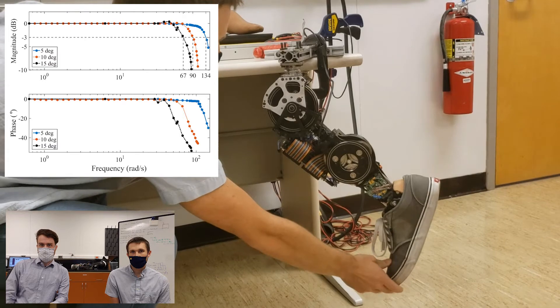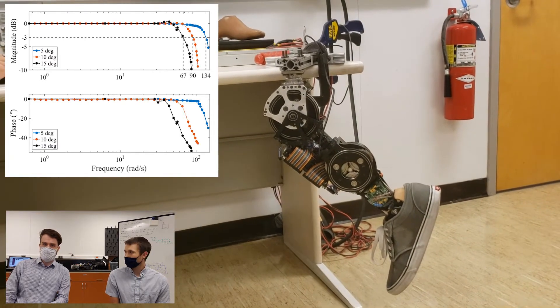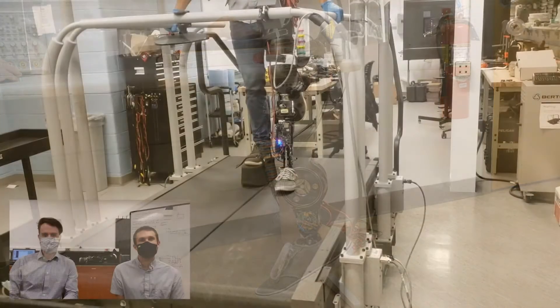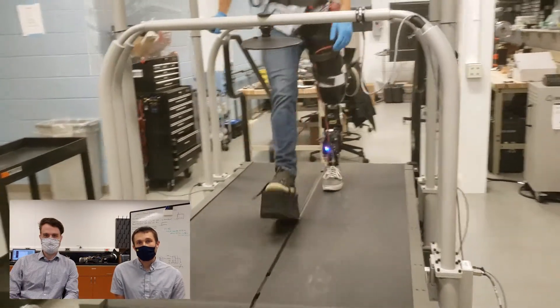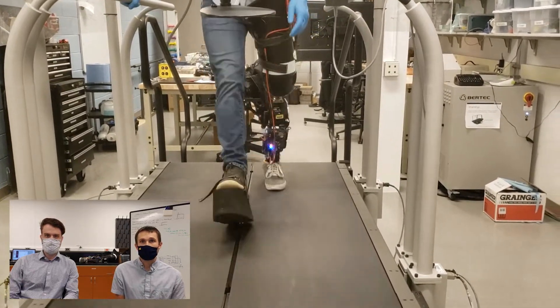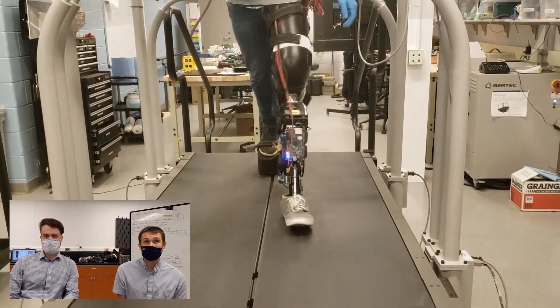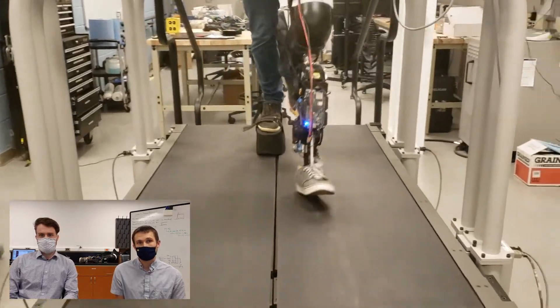Now we're going to cut to a treadmill demonstration in which Kevin walks on the leg with a bypass adapter. The treadmill footage you're about to see is actually my first day doing treadmill walking on this prosthesis. You may notice some compensatory behavior or slight stumbles as I got used to the bypass adapter and the shoe lift on the contralateral leg.